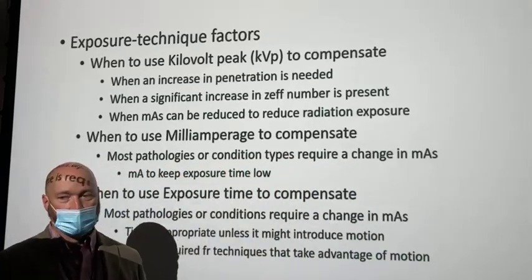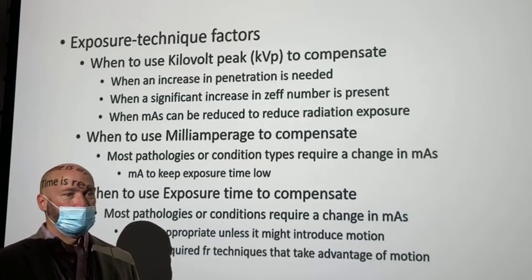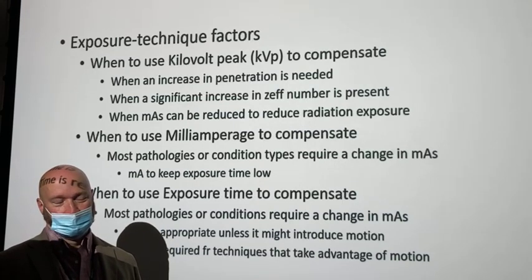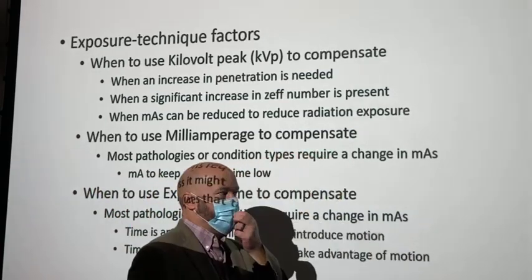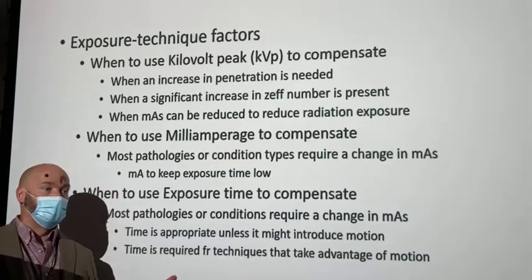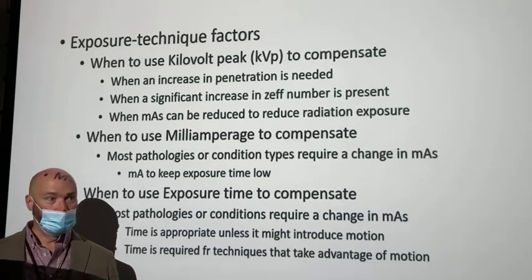But how do you adjust your exposure time on a portable? What kind of timer does a portable have? What's that? You may be working with one with automatic exposure control. They have them now. They didn't have them back in the day. The timers on portables are generally mAs timers, right? So you adjust your kVp and you can adjust it to whatever you want it to be, but your mAs is not separable into mA and time, right?